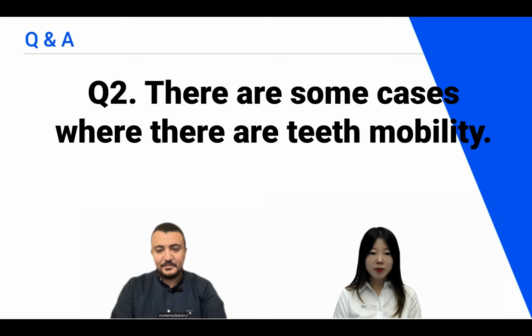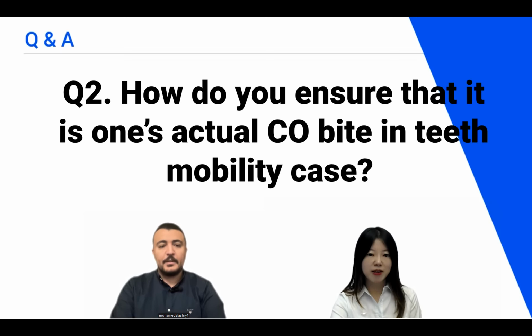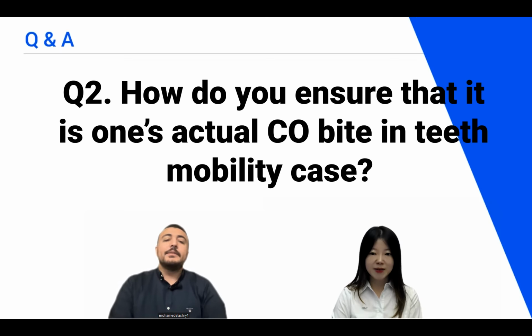Okay. Let's move on to question number 2. There are some cases where there is teeth mobility. So how do you ensure that it's the patient's actual CO bite in a teeth mobility case?